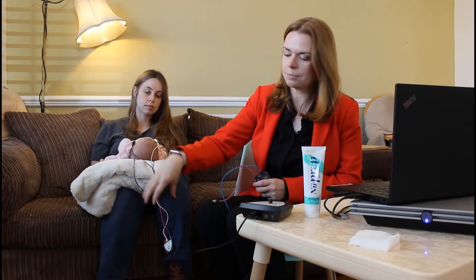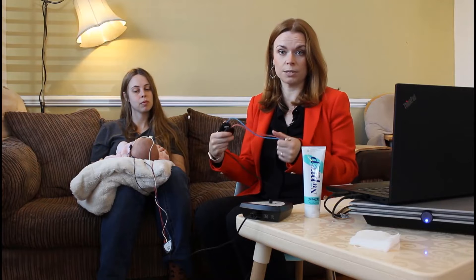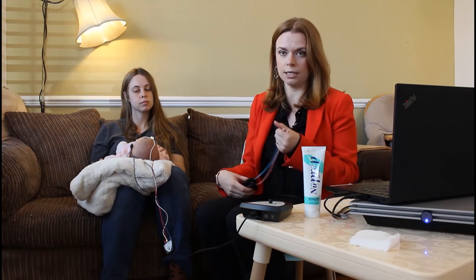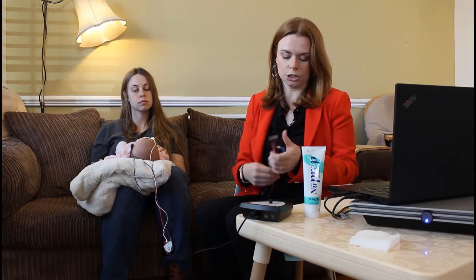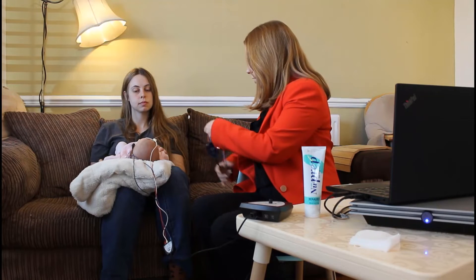We've got the electrode cables coming away from her, so ideally we want our insert earphones going in the opposite direction to reduce any interference. We don't want these touching, so I'm going to spin these around behind me and bring them over here.